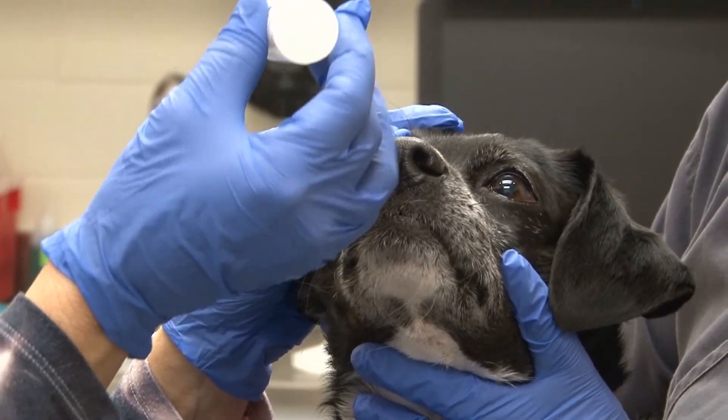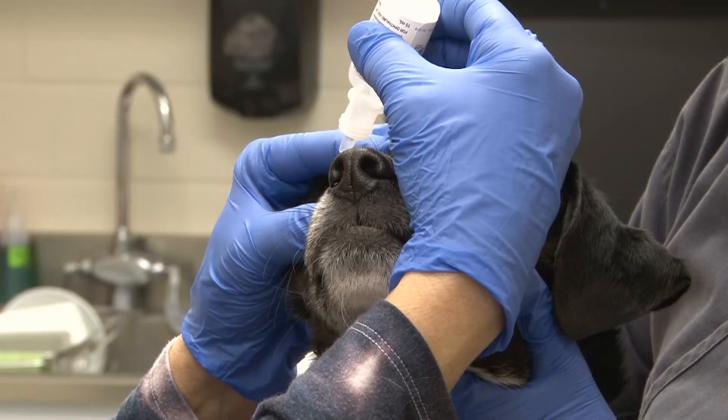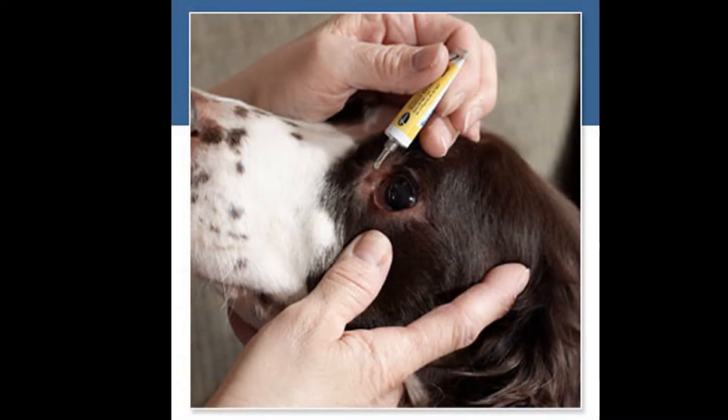Once she has that ready, with her medication in the dominant hand, she's going to put her dominant hand on the patient's head and hold the medication at least an inch above the eye to prevent the dog from wiggling and poking itself. She's not going to touch the dispenser to the eye or surrounding hair, and she's going to make sure she gives the correct amount of drop or applies the proper amount of ointment.